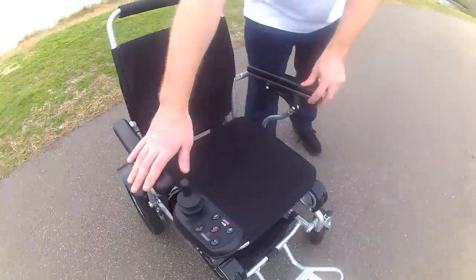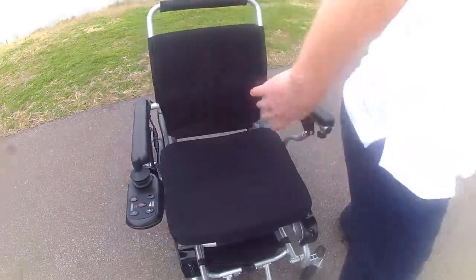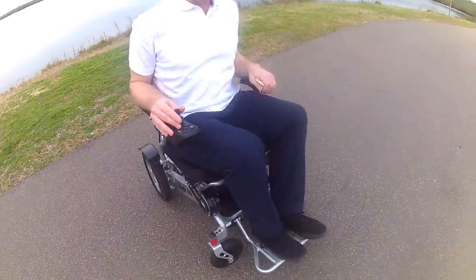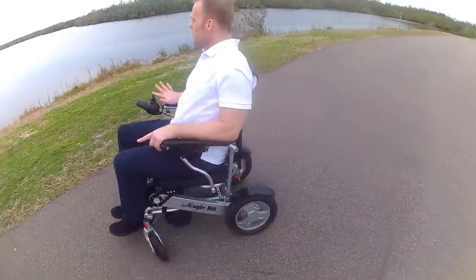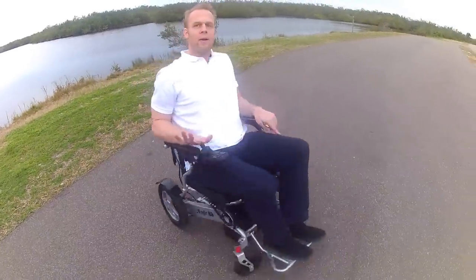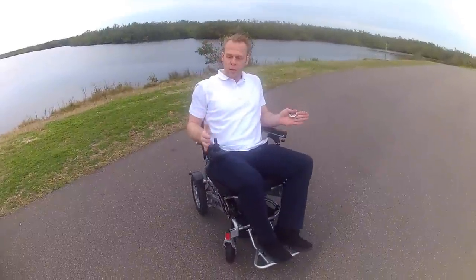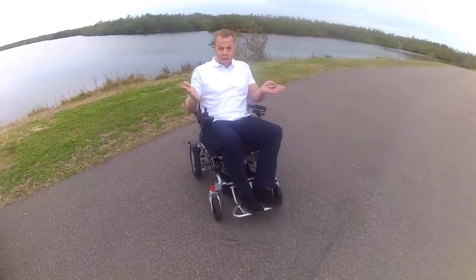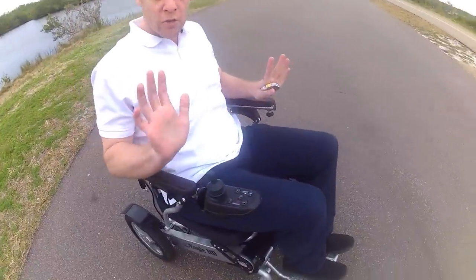Once the chair is on and the wheels are locked, with one finger you have a very tight turning radius and can go in literally 360s. It has an electromagnetic braking system, so when you take your finger off the joystick, the chair stops immediately.